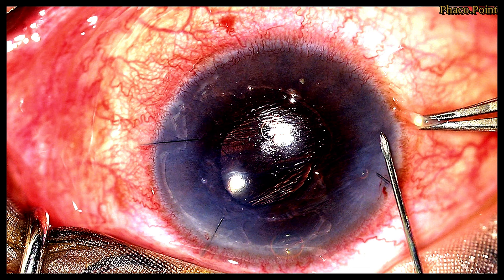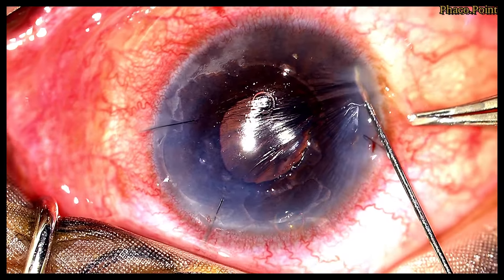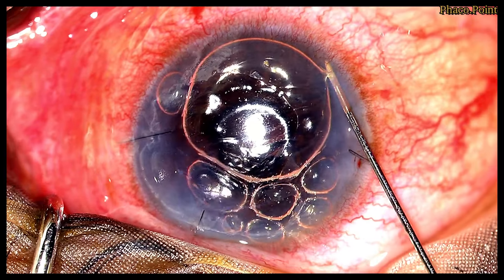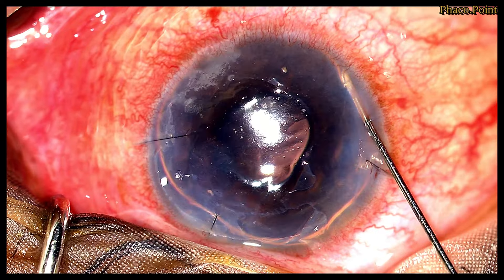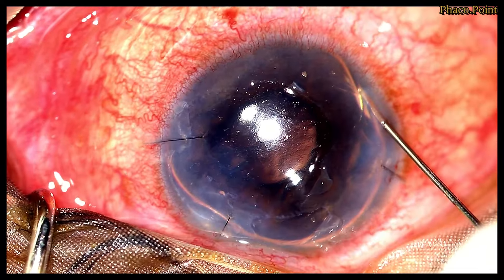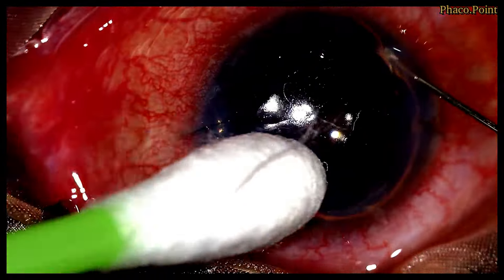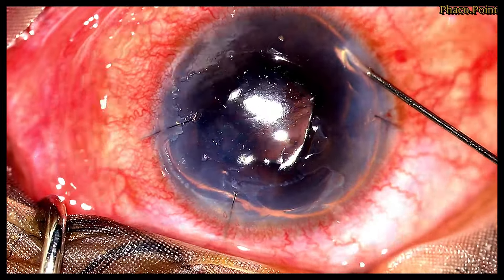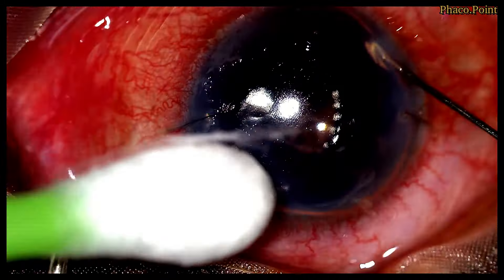A 30-gauge needle connected to a 1ml syringe containing 14% C3F8 is passed transcorneally through the cornea, dipped inwards into the anterior chamber, and then the gas is injected. Once I inject the C3F8, I retain this needle in the same position and watch for fluid coming out through the venting incisions. I keep intermittently injecting some more gas to achieve a rather tight air fill, then wipe out the beads of fluid that appear in the venting incisions.